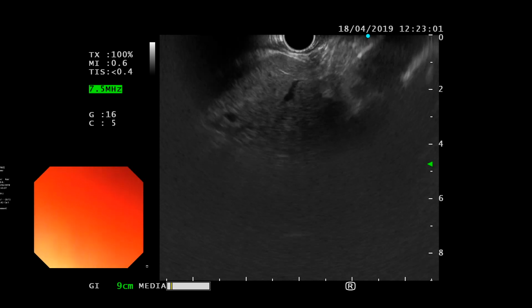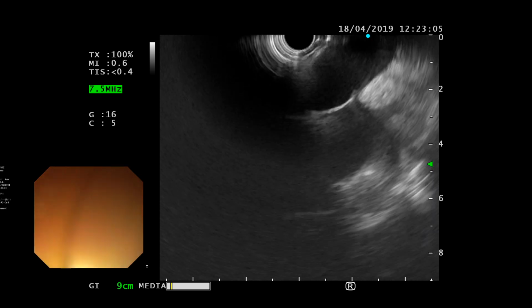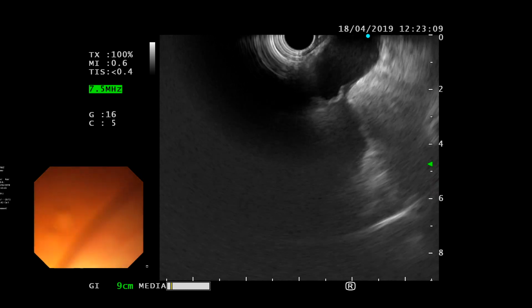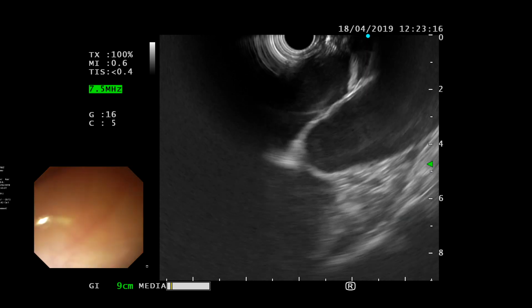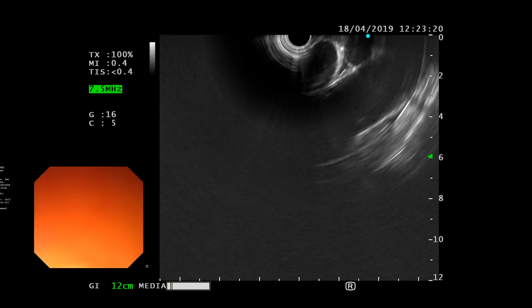So go ahead and now look at the mediastinum. Coming back, we should follow the aorta first. Or directly? I just usually, if you want to do it systematically, you can. However, this is showing you. If you thumb down, relax.